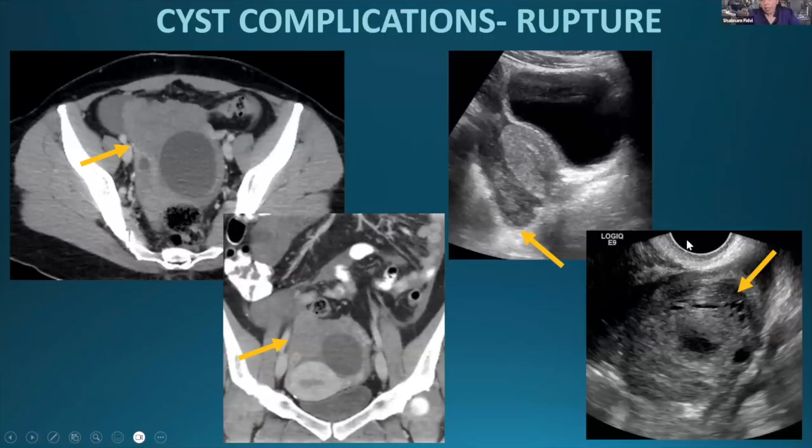On a subsequent transvaginal ultrasound, you can see a little bit of the ovary with some tiny follicles, but there's a lot of mixed echogenicity avascular material next to the ovary, suggesting blood products. So in both of these patients, there's probably a pelvic hemoperitoneum.